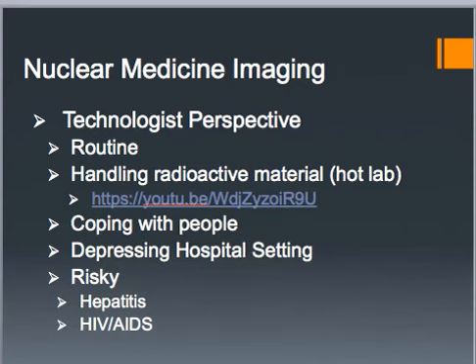So as you can see, what she's doing, there's a lot of safety involved with putting together all of the radiopharmaceuticals that you need for each patient. She was drawing up that amount in the syringe that she was going to give to the patient. The hot lab's usually not right in the nuclear medicine suite. It's maybe just right next door. But anytime you transport that, she put it in that lead-lined syringe holder because that syringe would emit radiation carrying it. So for her to even hold it in her hand, she would be exposing her hand. That's why you put the lead-lined barrier device in between the syringe and her hand while she's carrying it.